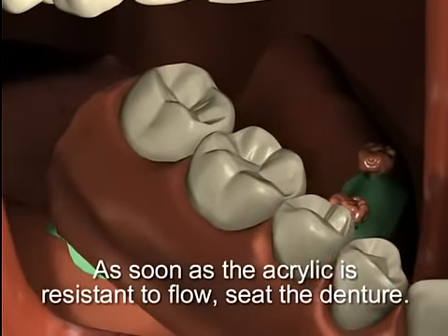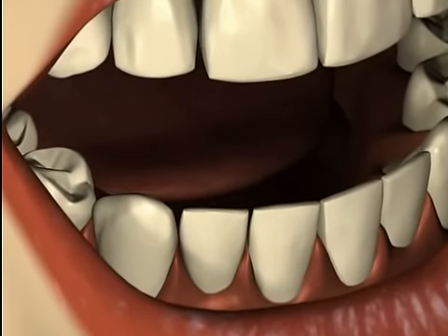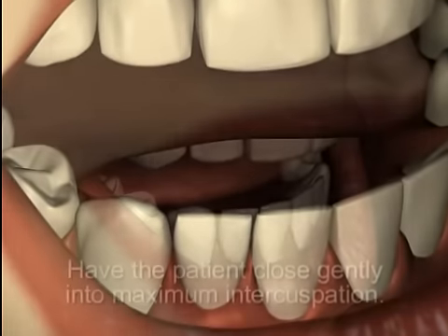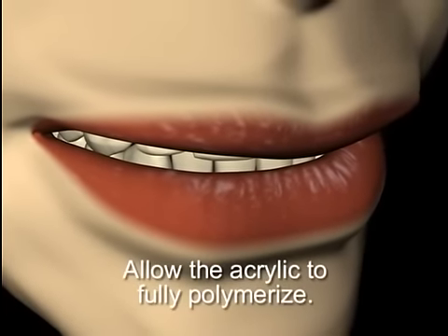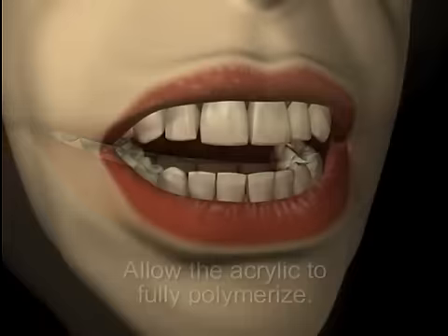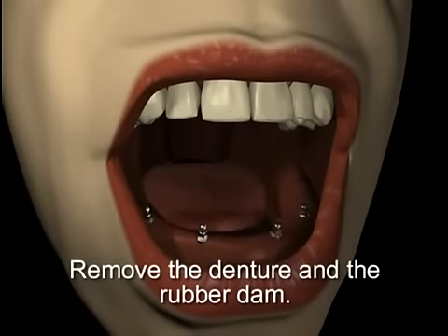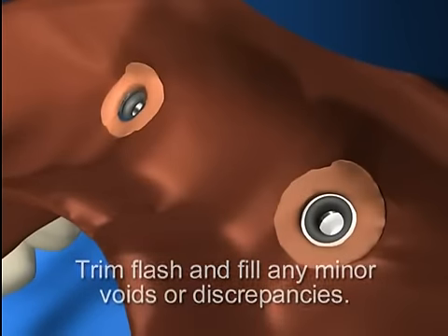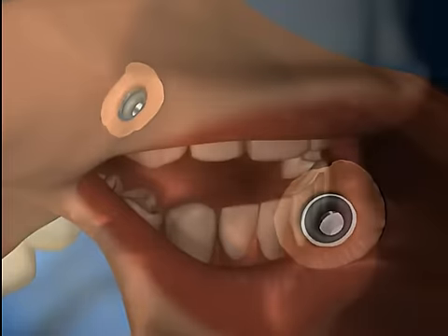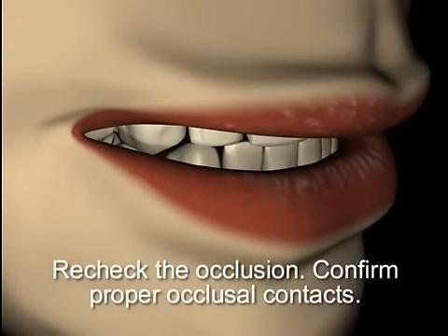As soon as the acrylic in the denture becomes resistant to flow, seat the denture, keeping light bilateral pressure on the occlusal surface. Have the patient close gently into maximum intercuspation. Allow the acrylic to fully polymerize. After the acrylic has set, remove the denture and rubber dam. Trim flash and fill any minor voids or discrepancies. Ensure that there are no sharp edges on the tissue-bearing surface of the denture. Recheck the occlusion. Confirm proper occlusal contacts.